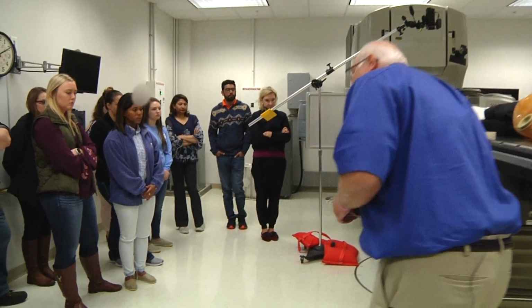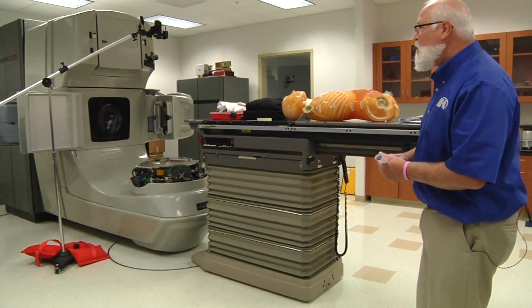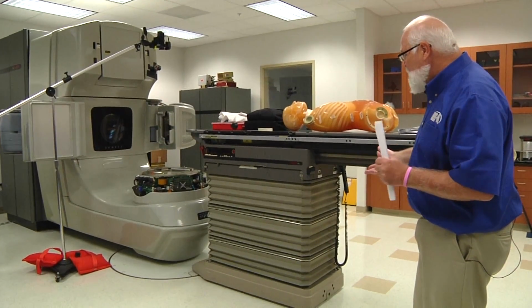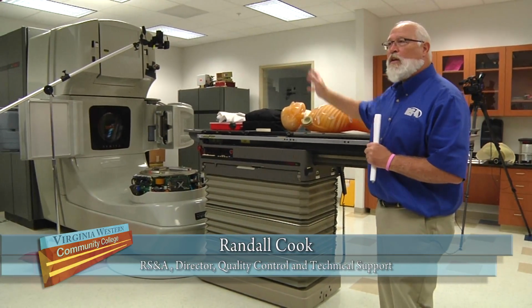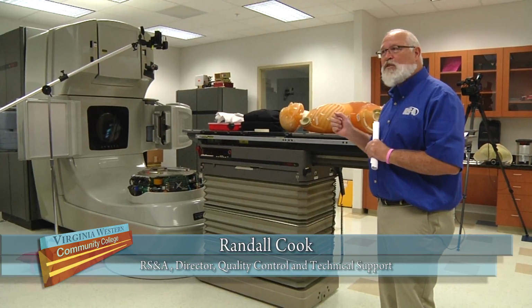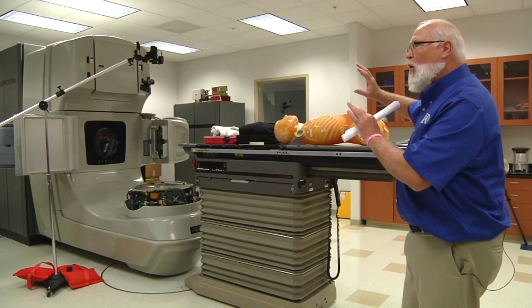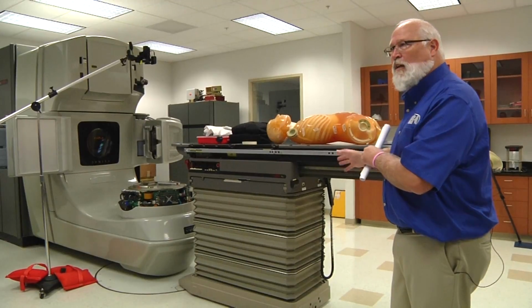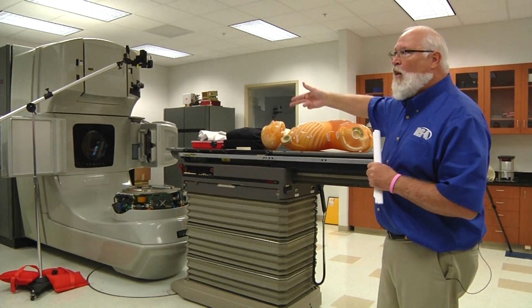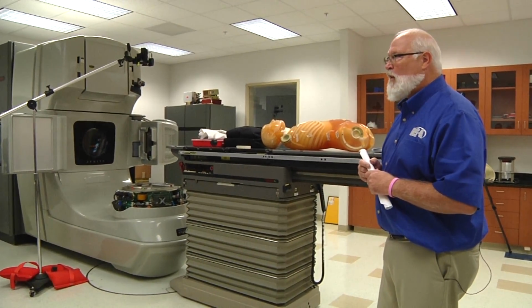This cover will drop down. It'll allow access in here. This is one of the things we inspect. So when we come and do a PMI on the machine, and PMI is preventive maintenance or inspection, that's what that stands for, we'll remove all the covers. Most of your engineers, they like to spend most of their time with a flashlight and their eyeballs, and they're looking for cable wear, they're looking for signs of water leaking or oil leaking or maybe your gas leak. They'll record how many times, or if you tell them how many times you're adding gas to the system, that tells them there's a leak.